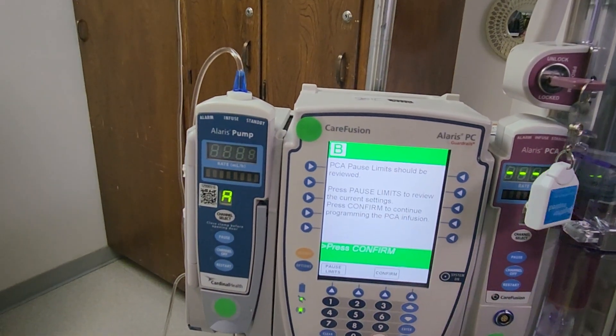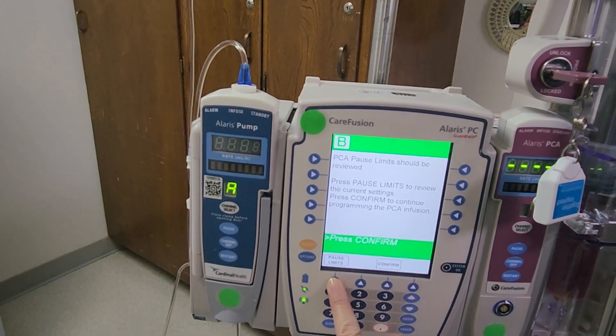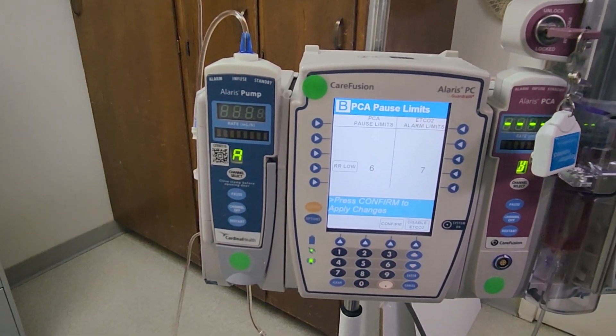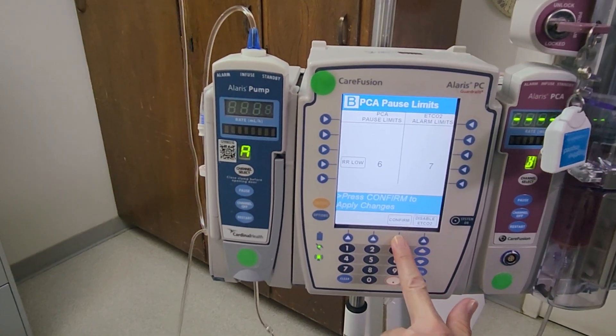Now it's asking me to confirm the pause limits to verify that. There's a button down here — push pause limits and check to make sure it matches your orders. You can make changes, but in this case I'm going to confirm to move ahead.